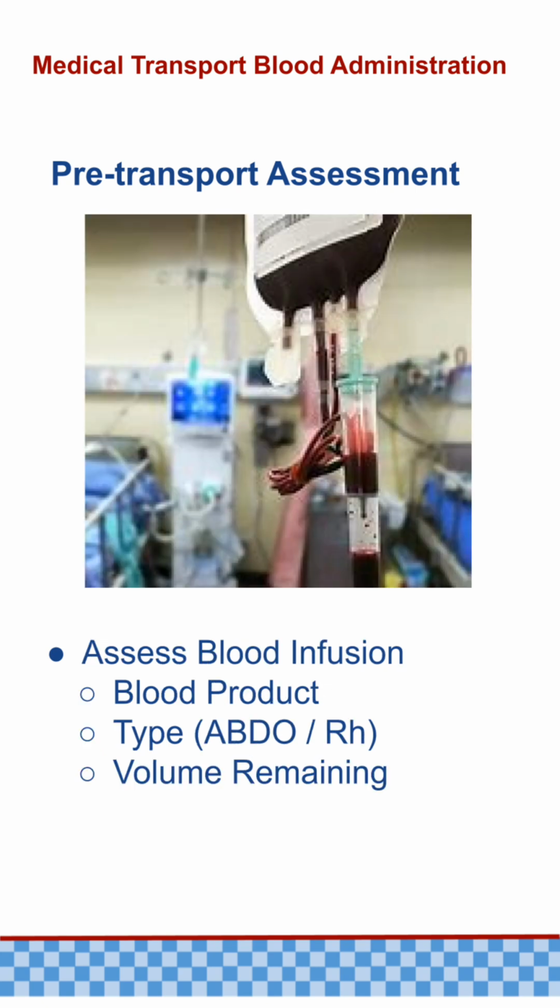Next, turn your attention to the infusing blood product itself. Once again, Keystone Quality Transport is not initiating blood infusions in the pre-hospital setting. Keystone Quality Transport will only transport patients with a running blood infusion that was initially at a medical facility prior to transport to another facility.